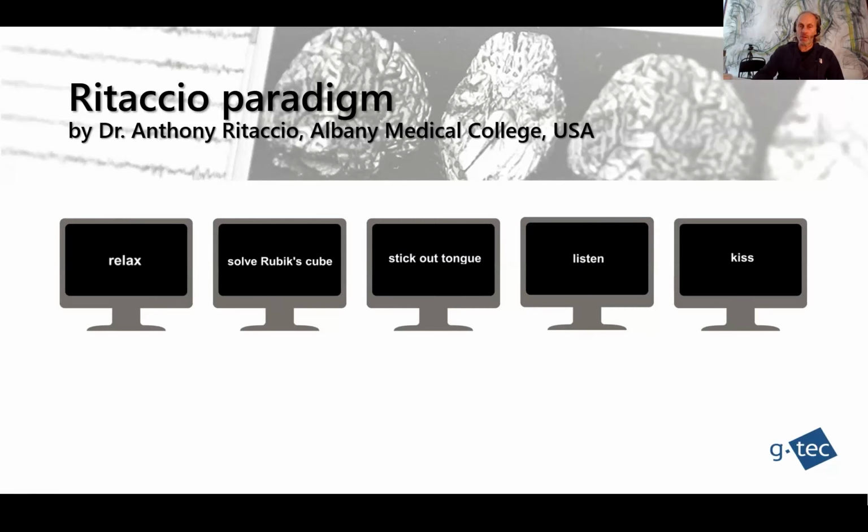And these are very important centers of the brain. And the neurosurgeon learns actually what he should not cut out. This also allows the surgery to be done more precisely.